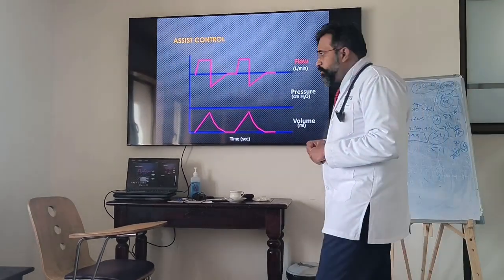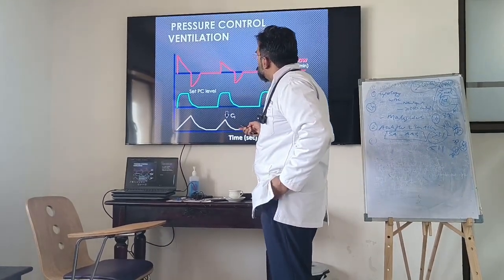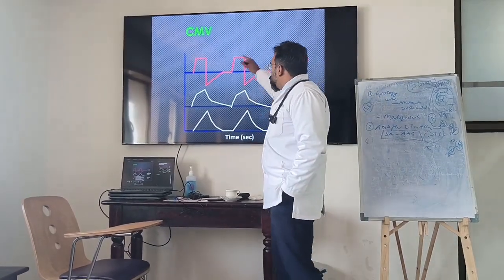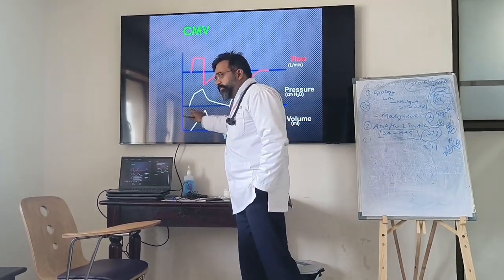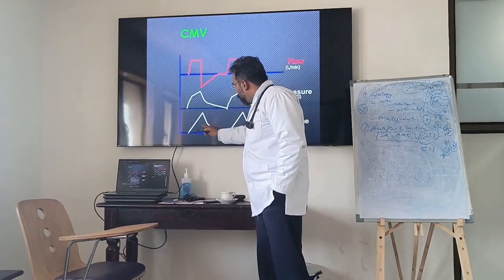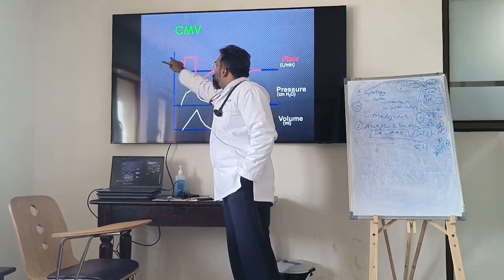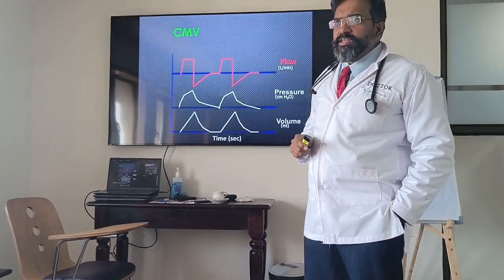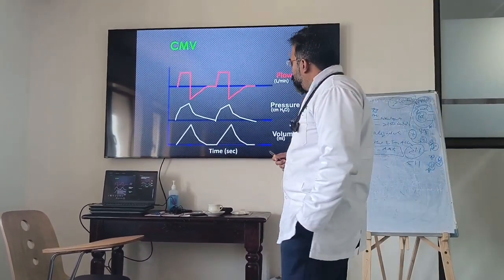Let's go to this breath. Now, as I told you, what are these called as? Scalars. These are called as scalars. So, what I am showing as scalars, you can actually interchange anything here, there, and you can do on the ventilator. So, when I am seeing this scalar, this is pressure over time, this is flow over time, and this is volume over time. That means what I am seeing here is volume, what I am seeing here is pressure, what I am seeing here is flow. Clear? What I see here is pressure, flow and volume.